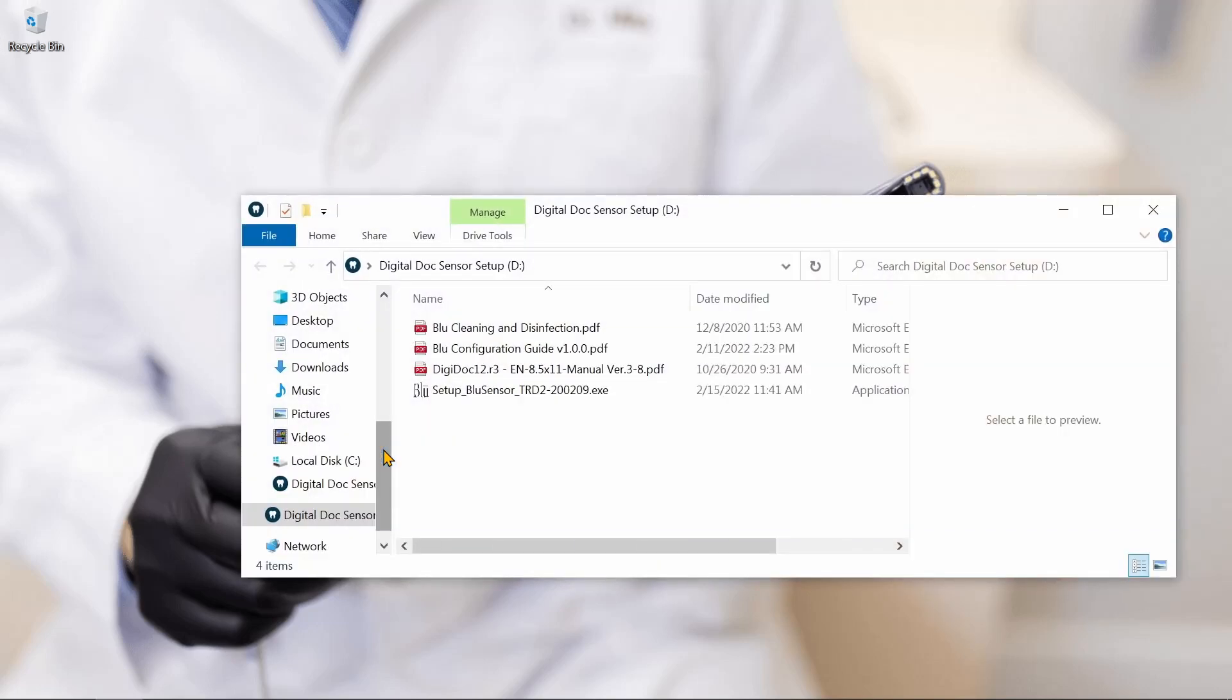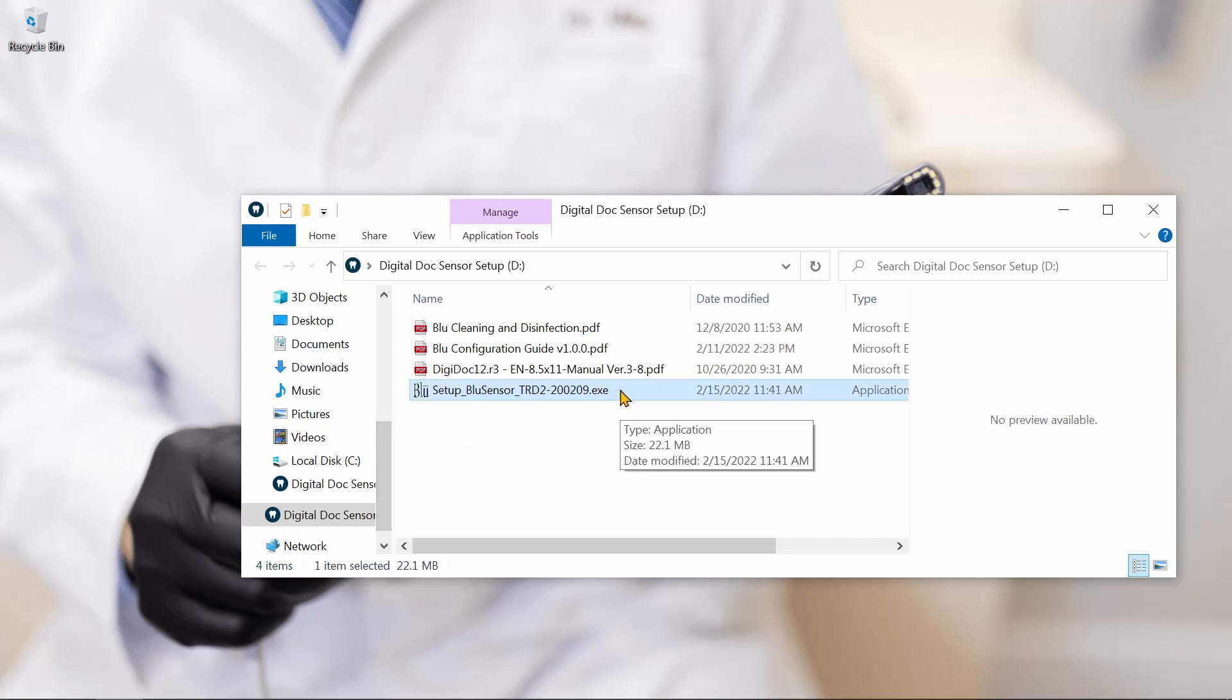Each individual sensor will come with a flash drive which will contain the installer file for that specific serial number and other information about your sensor.